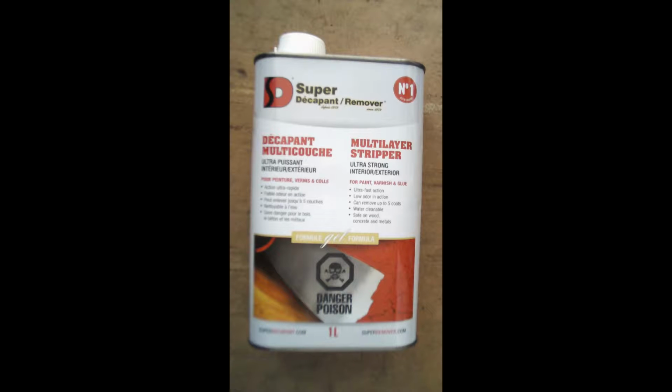Now that I've gone through some general tips that will help in the removal of the tires, let's get into the steps I took to repaint my hubcaps. I purchased this heavy-duty paint stripper. There are environmentally friendly paint strippers. I chose this heavy-duty version because the manufacturer coating feels like a baked-on plastic rather than paint. I felt the stronger paint stripper was necessary to get down to the bare metal, similar to the idea of removing 10 or more coats of paint.